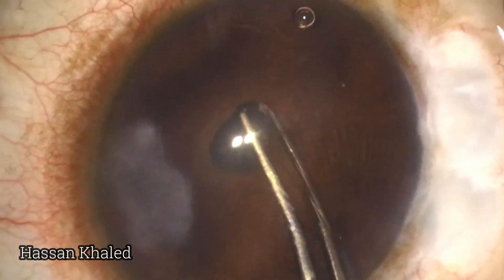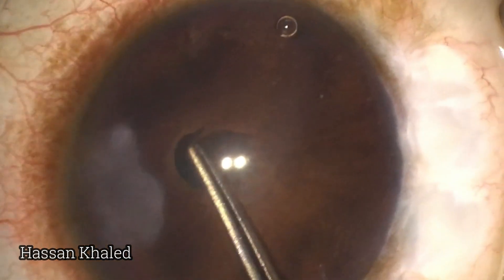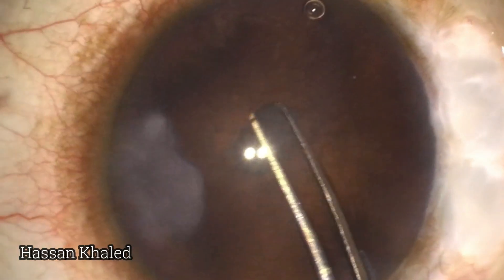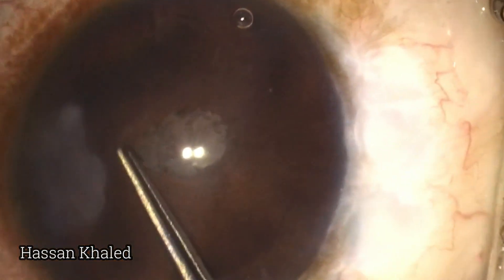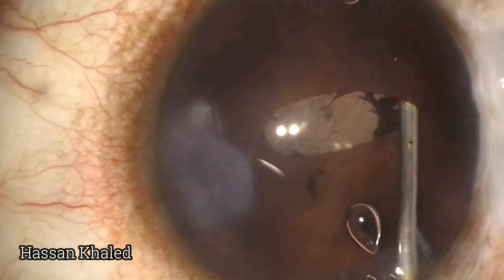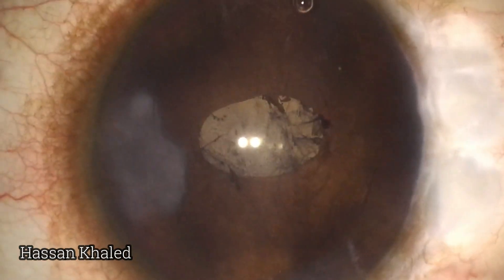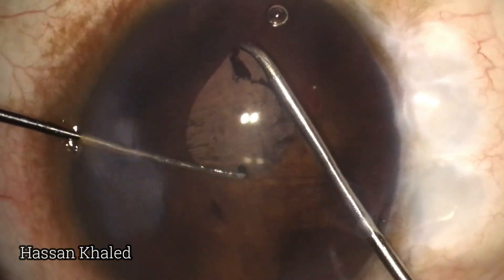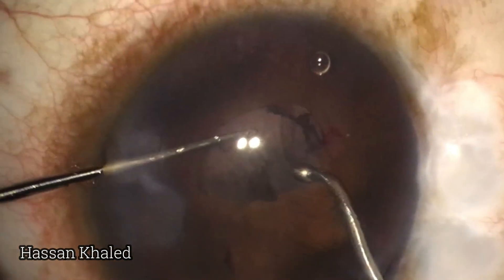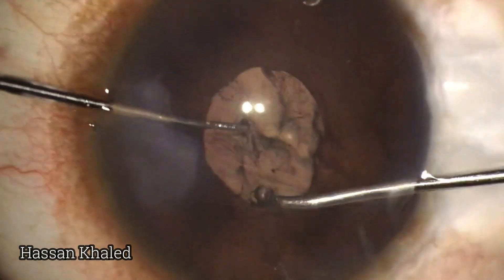As there is adhesion between the iris epithelium and the anterior capsule, I inject dispersive OVD behind the iris, trying to separate the adhesion between the iris epithelium and the anterior capsule. I also stretched the pupil, trying to dilate it, to prepare for insertion and implantation of the Malygin pupil expander ring.